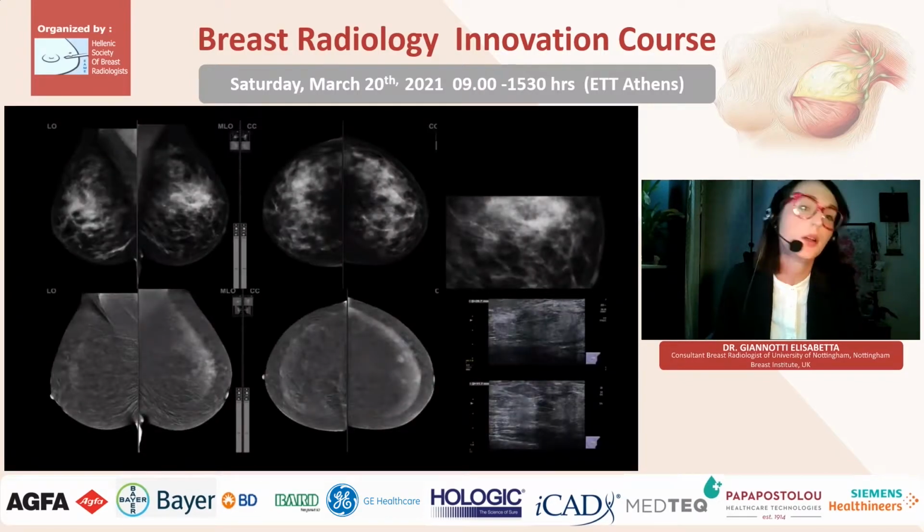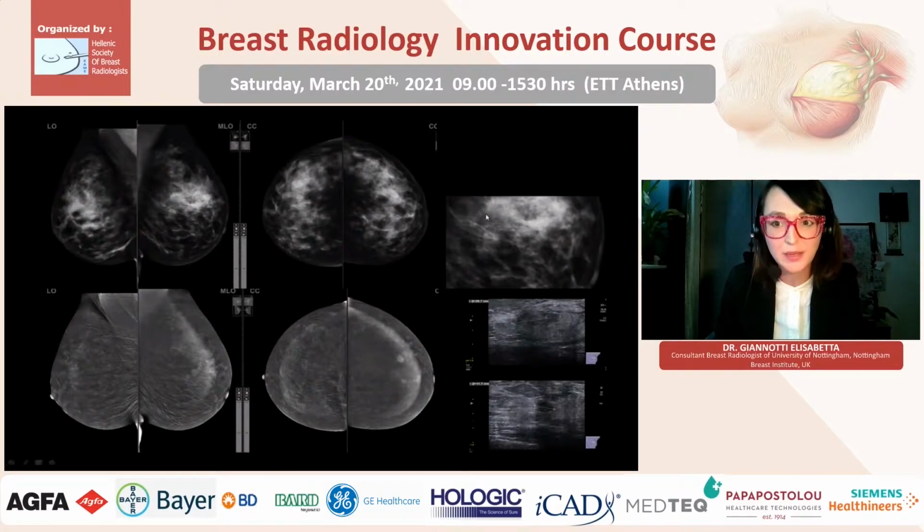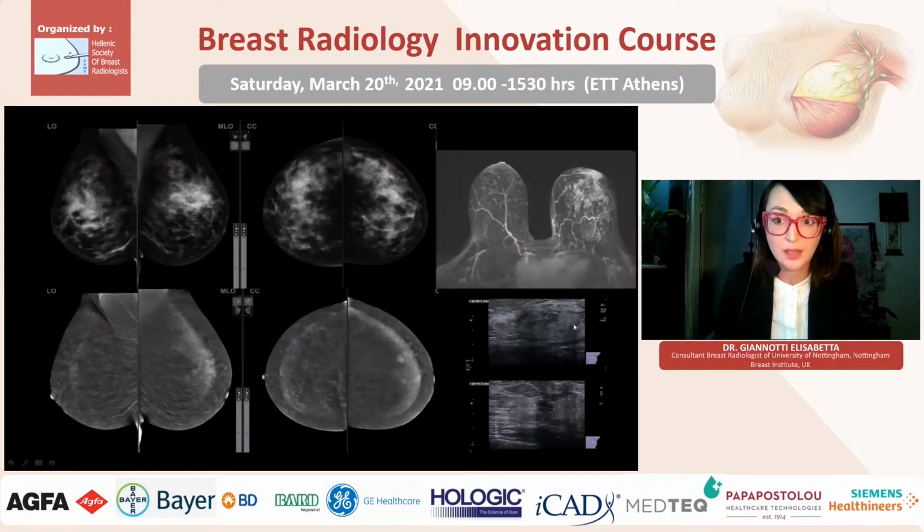So this is an example. I'm very sorry that it would be difficult to see the calcification, but please believe me, there is a large area of microcalcification centrally in the left breast, and on contrast mammography in the recombined picture, there is a background parenchymal enhancement, but the enhancement shows us the invasive component. It was confirmed on ultrasound. So basically on contrast mammography, in presence of microcalcification, we can identify the invasive component. And we can see that it recalls the same enhancement of the MRI.